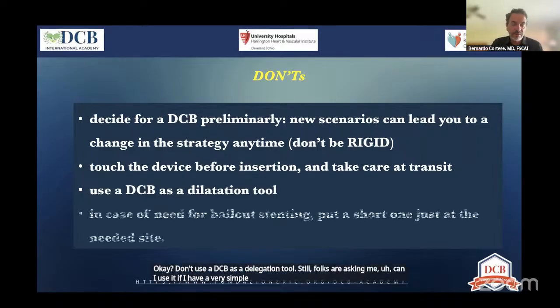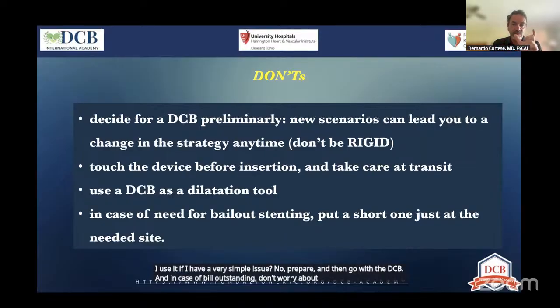No, prepare and then go with the DCB. And in case of bailout stenting, don't worry about that. Put a short stent where you just need it.